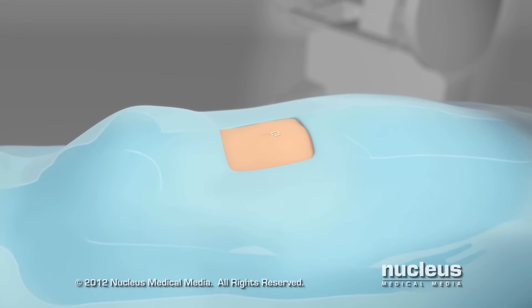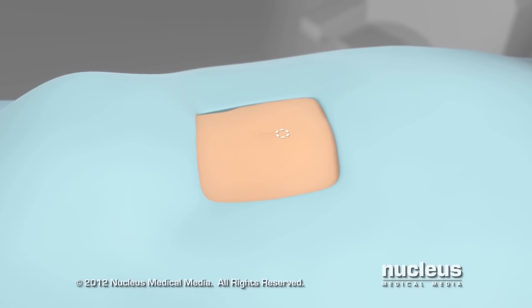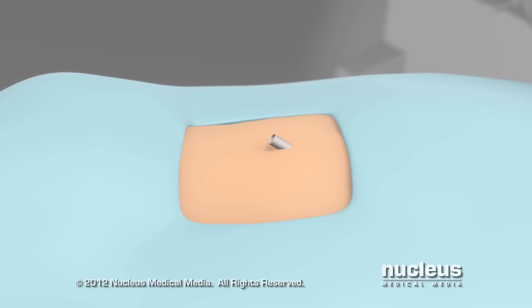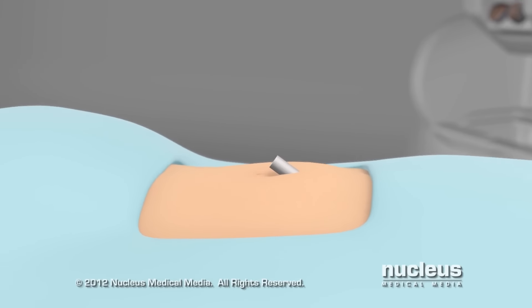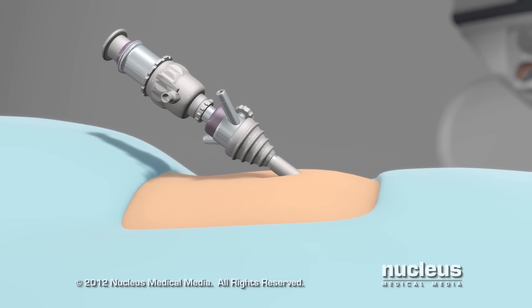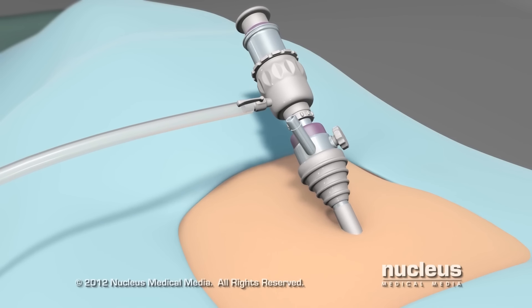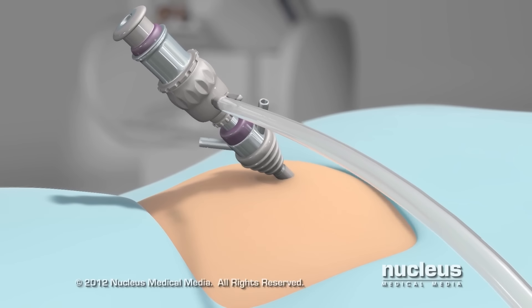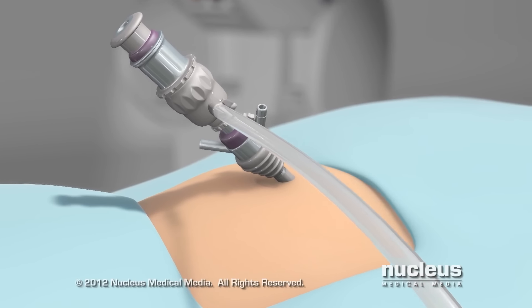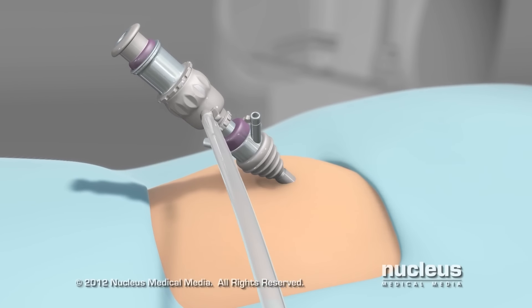Your surgeon will make a small incision near your belly button and insert a plastic tube called a port. Carbon dioxide gas will be pumped into your abdomen through this port. The gas will inflate your abdomen, giving your surgeon more room to see and move the surgical tools.